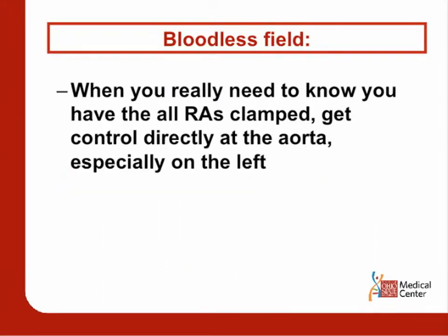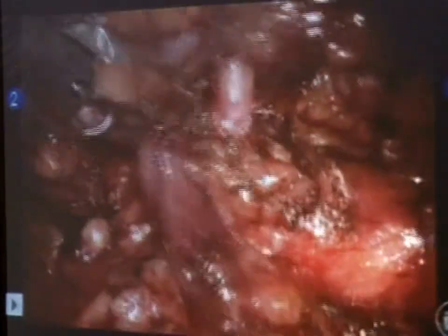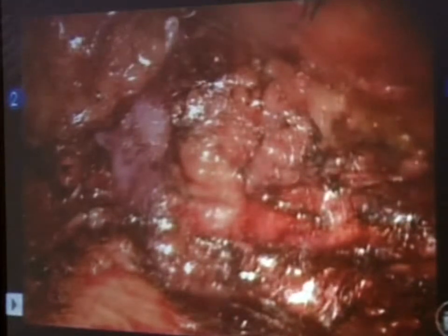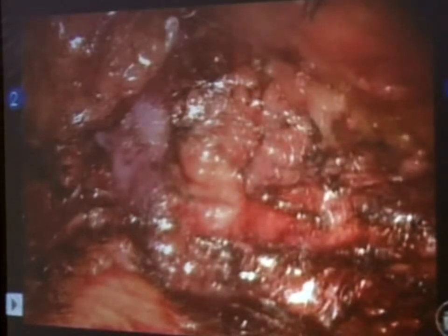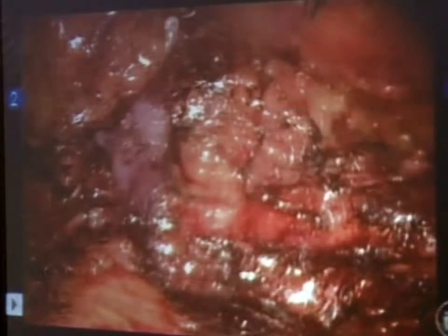On the left side, one way to be sure is to work right on the aorta — you have more room and can make sure you get the right artery. If the artery looks too small, don't believe it's the only one. I don't care what your CT or MRI showed — make sure there aren't other arteries when doing a completely endophytic tumor. For an exophytic, easy chip-shot tumor you might get away with missing one. But if you have a completely endophytic tumor and make that mistake, it can turn into a nightmare.